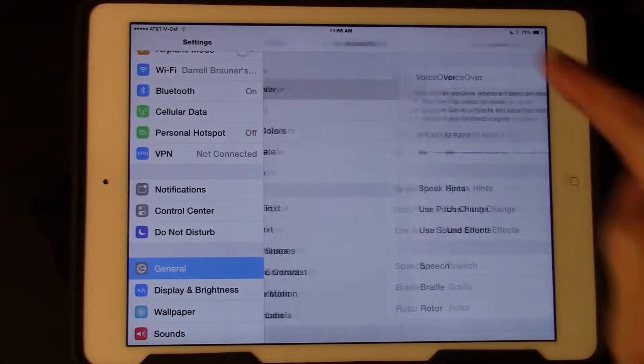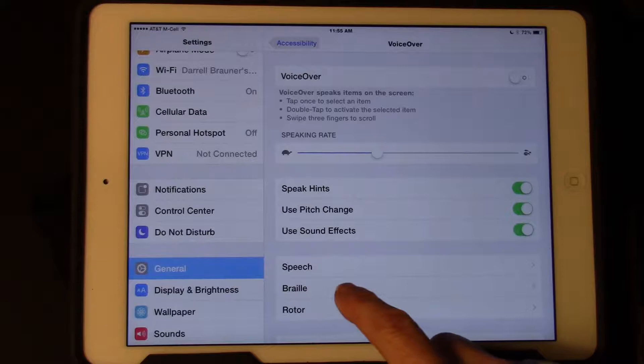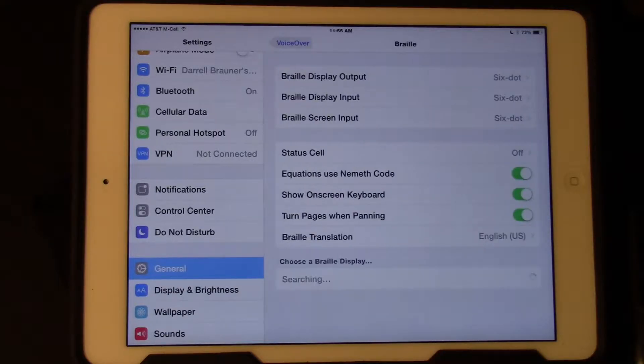Tap on VoiceOver. Tap on Braille. It's going to search. There it popped up — the refreshable braille display. I'm going to tap on that.